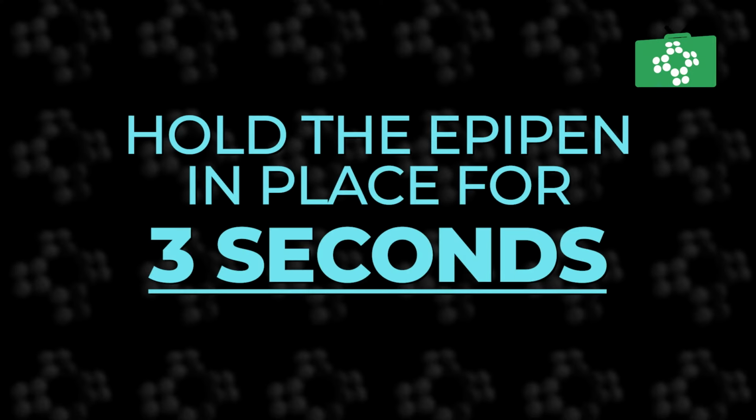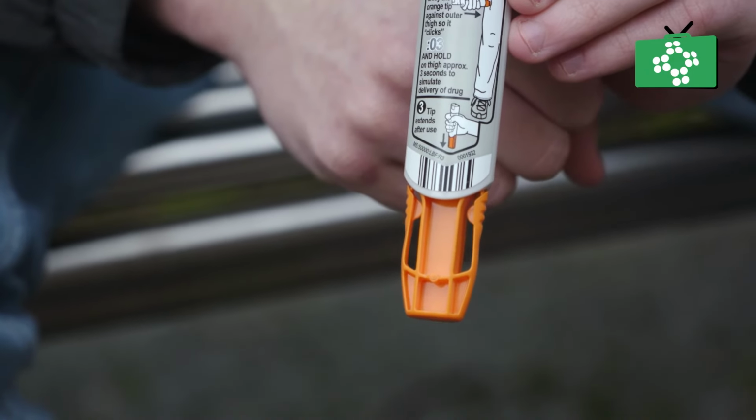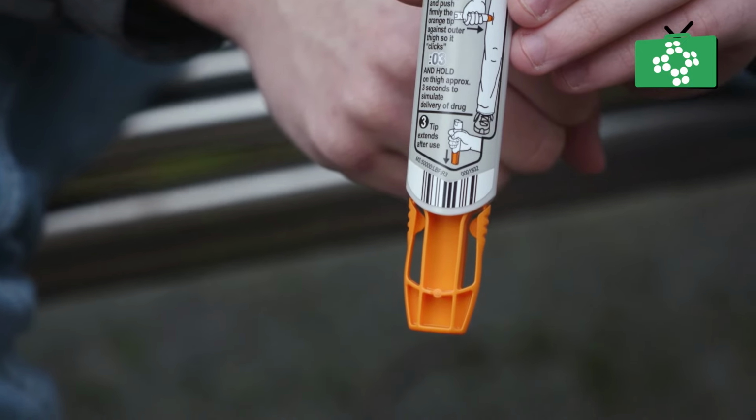Once the needle has hit, hold it there for 3 seconds and then remove it. Stay where you are until the emergency services arrive. If you're treating someone and they are unconscious, place them in a recovery position. When the EpiPen has been used, a needle cover will appear automatically over the needle to prevent anyone getting injured.